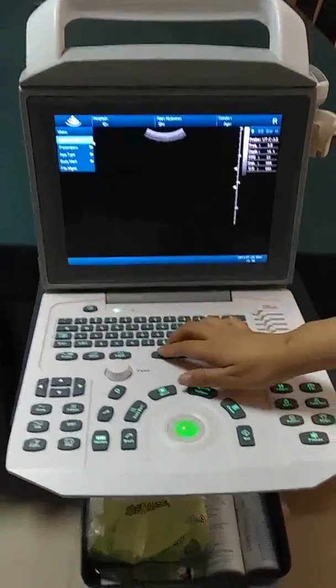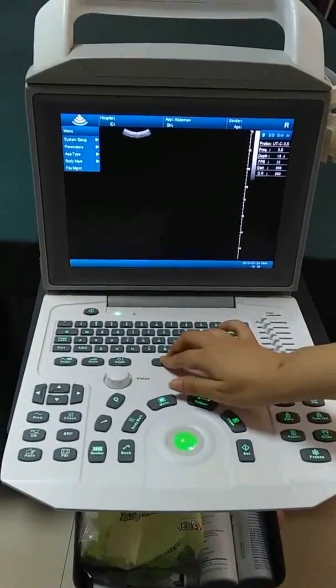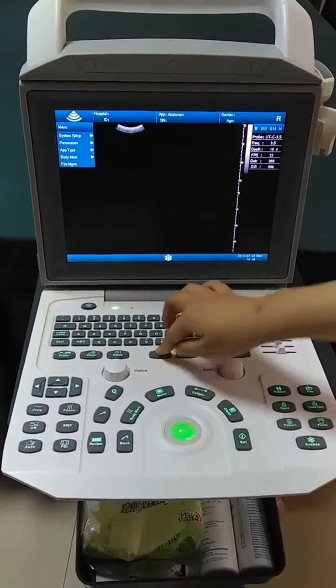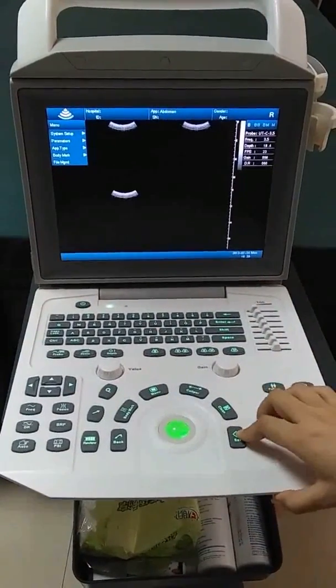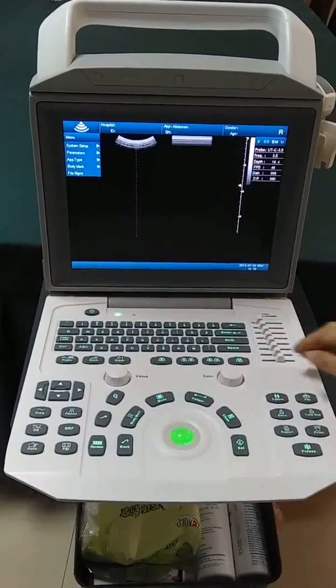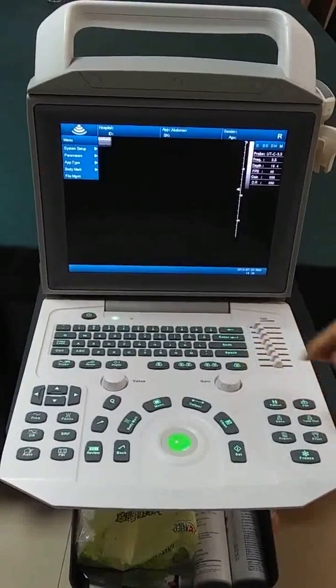Here you can see the imaging modes: B mode, Double B mode, B+M mode, and M mode.